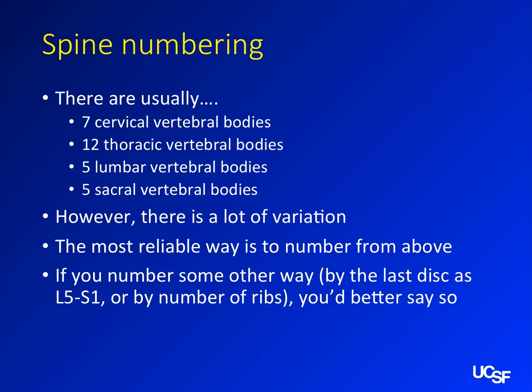And I think the templates, for lumbar spine for instance, even have that in there. I would encourage you guys to at least pay attention to that, even if you're not saying it in your reports.